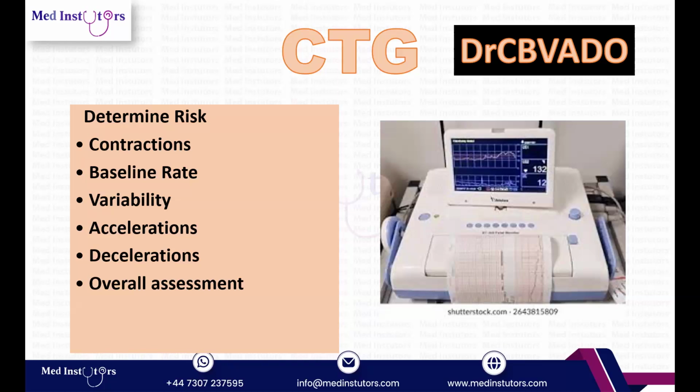Okay. Now, here for CTG interpretation, we have a short form, that is Dr. C. Bravado. DR means determine risk. C means contractions.